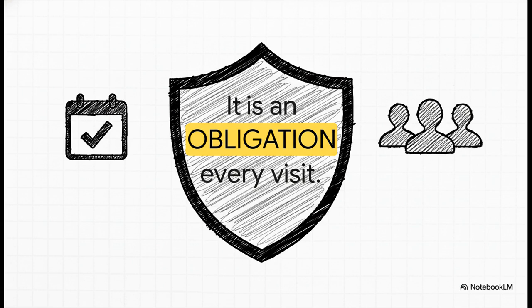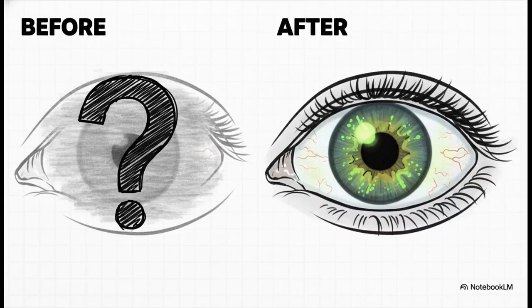Because, as we all know, a patient feeling good doesn't always mean the lens fit is good or that the cornea is healthy. And you know what? The exact same hard and fast rule applies to staining. As specialist Diego Lopez says, if you call yourself a contact lens specialist, you should be using a ton of fluorescein. It's the only way to truly see what's happening on the surface of the cornea. Without it, you're basically flying blind.